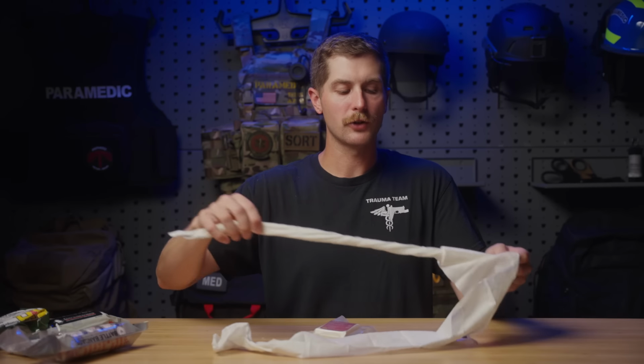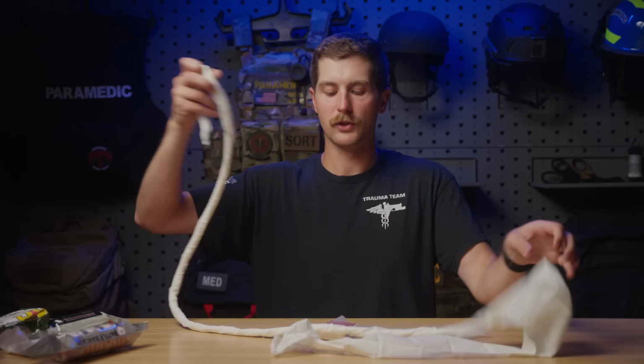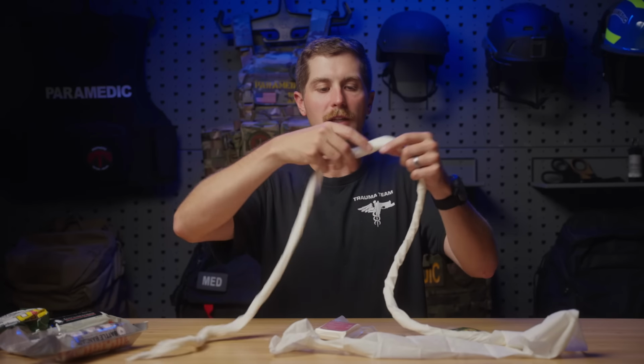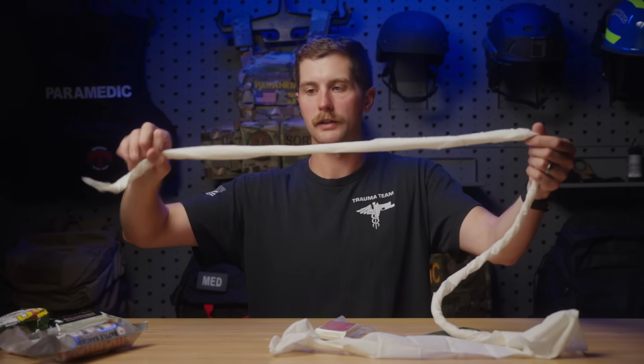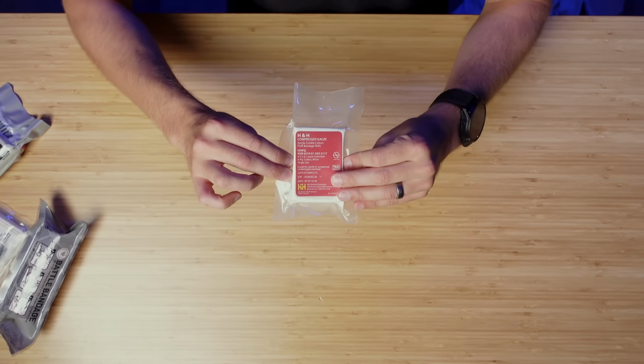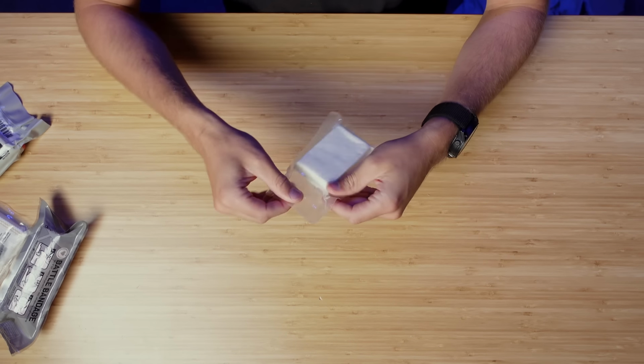So kind of interesting thing, it kind of comes out like the inside of a toilet roll, and then you just pack that in the wound like you would any other gauze. Obviously it comes out as kind of like a trunk, a tube, but that's not going to harm you in this instance. All right, now, last but not least, we have the H&H compression gauze here.